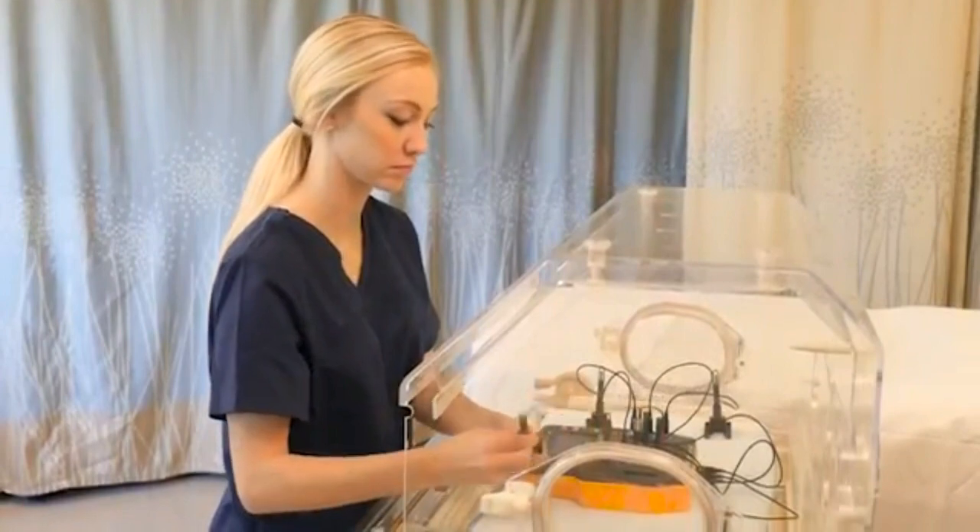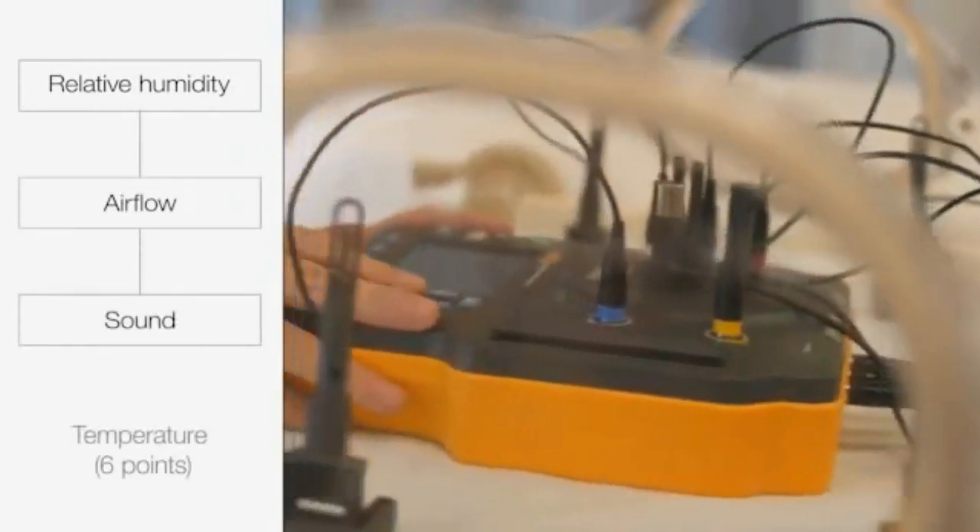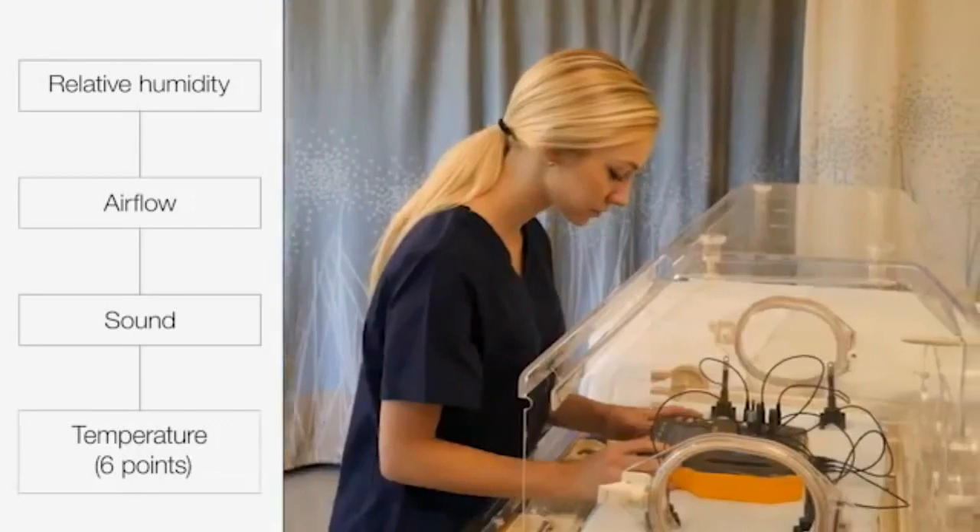Intuitive and easy to use, the Inq2 can simultaneously measure relative humidity, airflow, sound, and six independent temperature points.